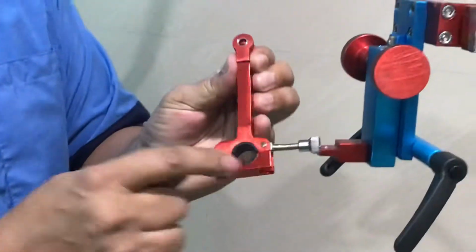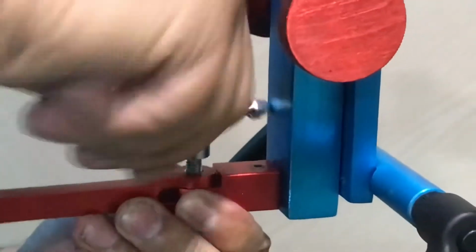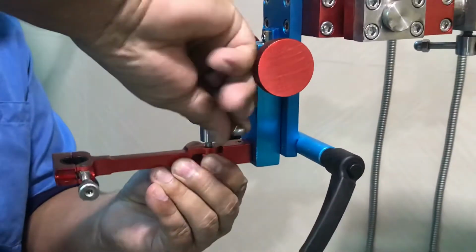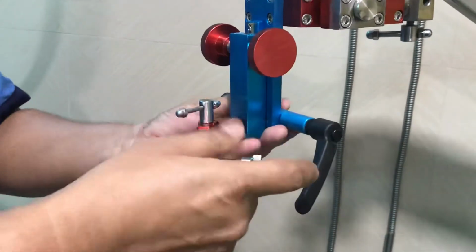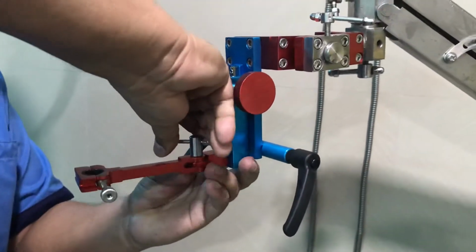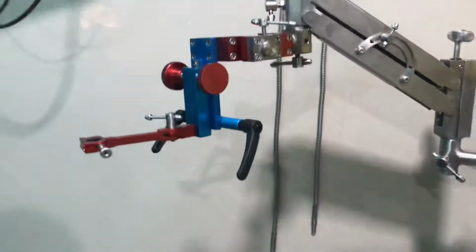So this is one which is fixed like this, and this is for mostly all the Karl Storz endoscopes. So you fix it. You can have all these positions here, okay? So whenever it is crimped, you fix it, and then you can attach the endoscope.